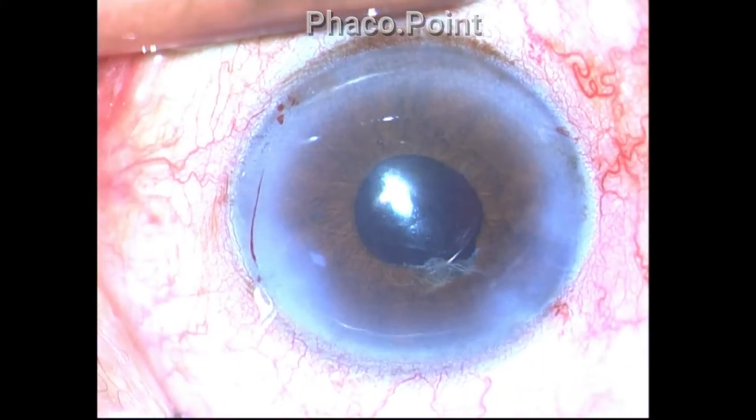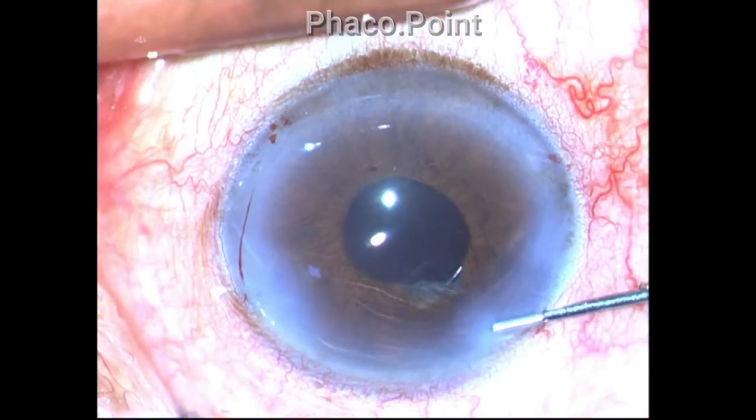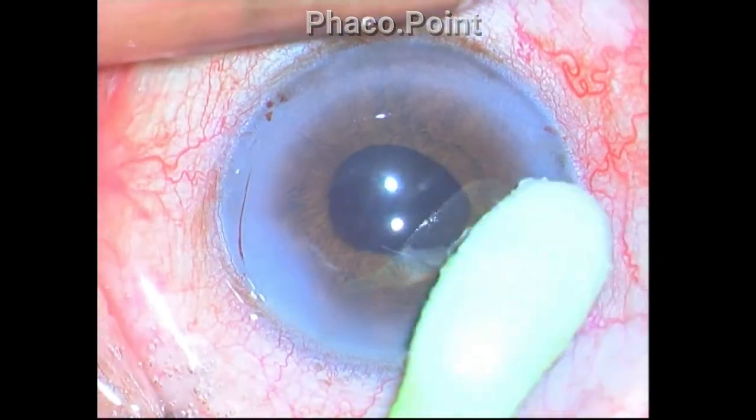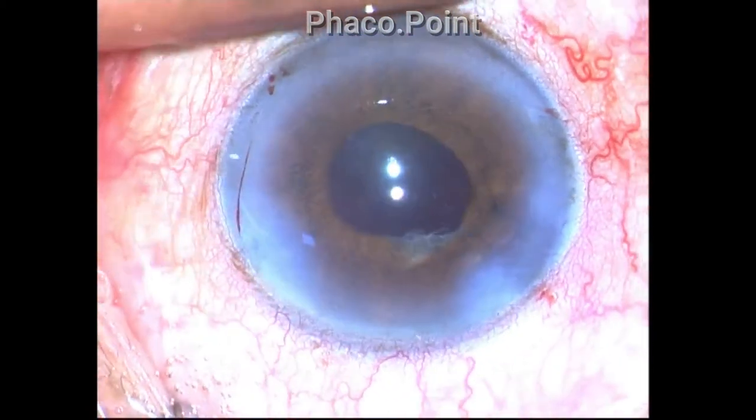The prolapsed iris is once again reposited. Stromal hydration of the incision is carefully performed, the wound is checked for water tightness, and that brings us to the end of the case.